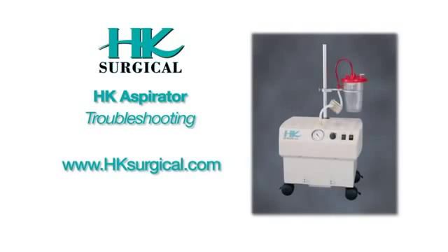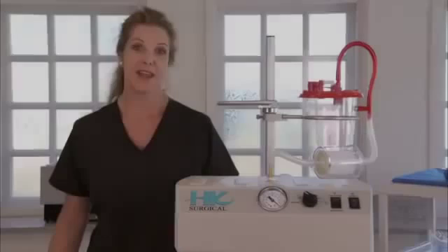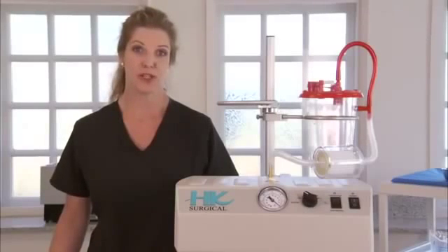Should any problems arise with your new HK Aspirator, there are several items you can check prior to calling our service center. Please review the following instructions and verify all are correct. Most problems are very minor and can easily be corrected without having to return the unit. Now I'm going to take you through some troubleshooting options for your HK Aspirator.